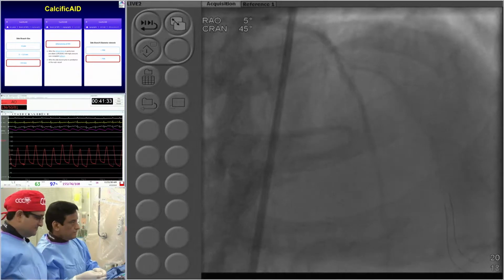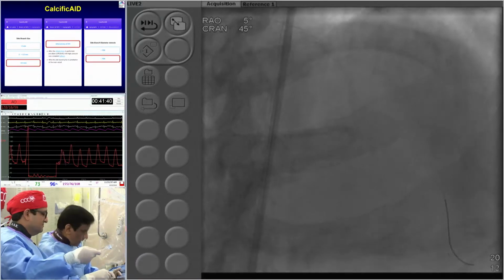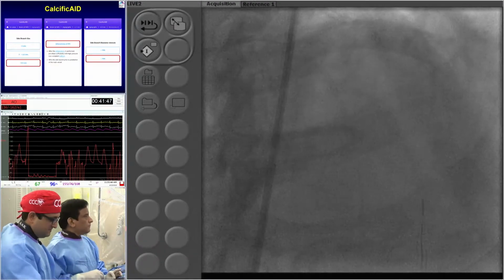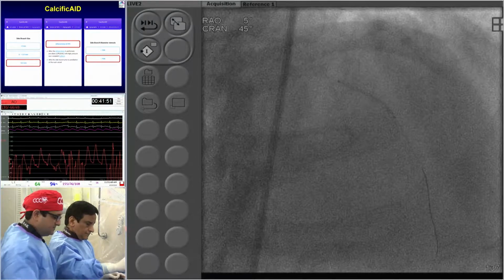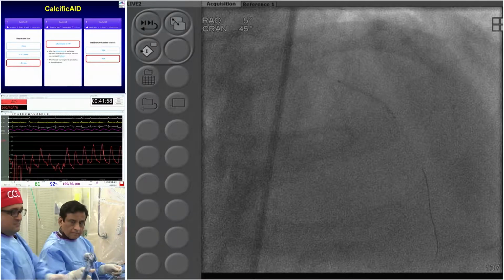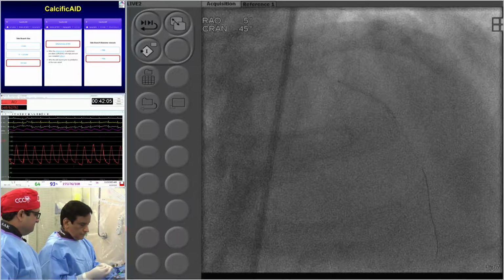But to be honest, a young diabetic patient with multivessel disease is likely to do better with CABG than PCI for most cases. And as you know, I just did a large review of the literature for acute kidney injury associated with contrast in the New England Journal, just published last week. I'm not so sure about this particular case, but you're going to tell us, what are you doing with contrast media for this patient? What did you do to preserve the function of this particular patient?